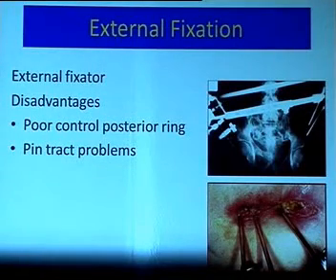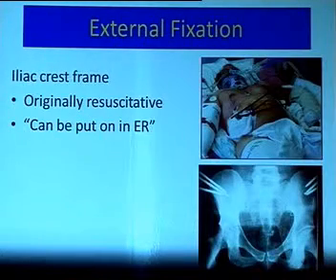The problem with external fixation is it poorly controls the posterior ring, and there are pin track problems and problems with mobilizing the patient with these devices in place. And these pictures on the right show this rather nicely. The iliac crest frame was the original frame.